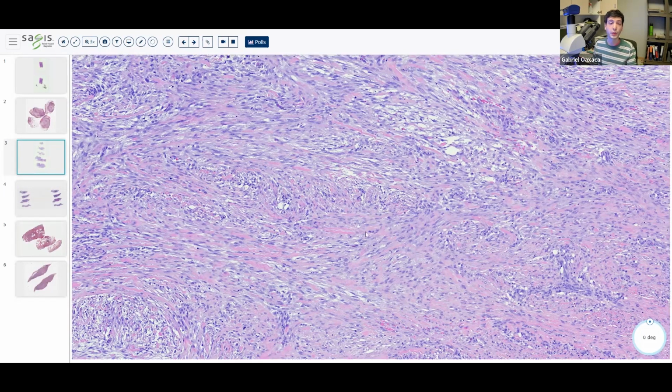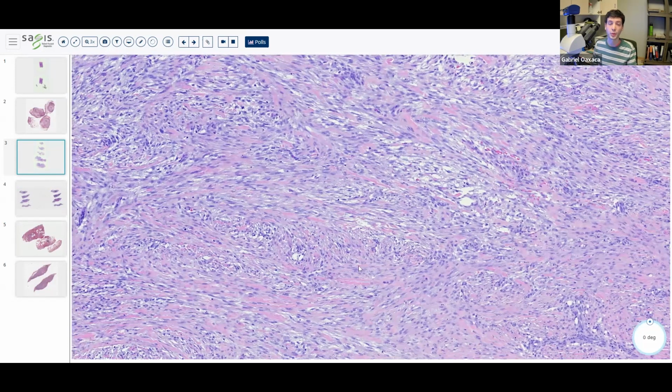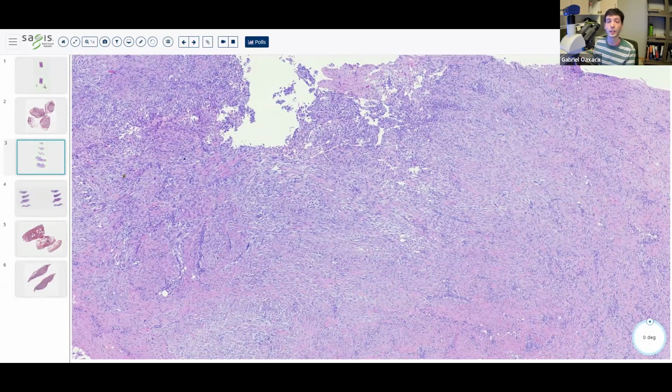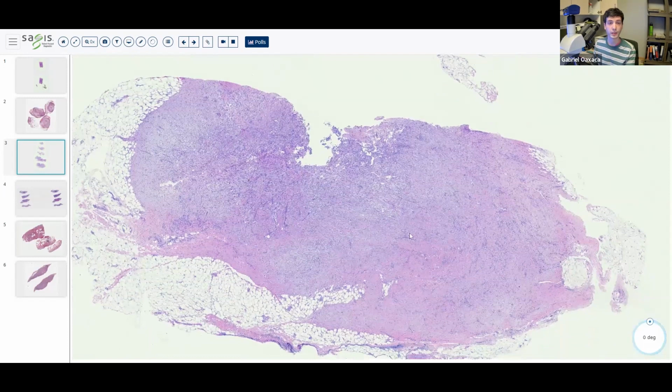And if there was any further doubt, then there could be some immunohistochemical support with a beta-catenin for desmoid fibromatosis, and that would be a nuclear stain for beta-catenin in desmoid fibromatosis. In some rare instances, one might consider a low-grade fibromyxoid sarcoma, and the stain that would help differentiate for that would be a MUC4. All right, I think that's good for nodular fasciitis.